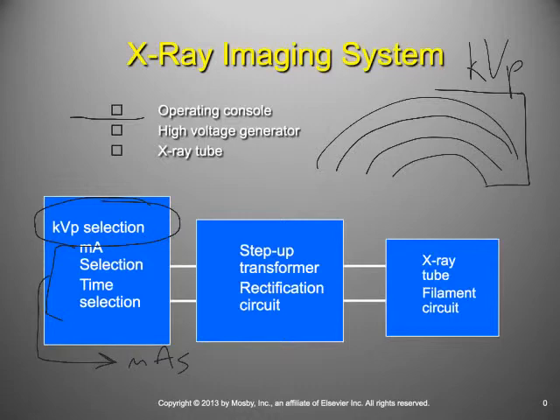So this is an amount of time that I'm going to charge something up with an amount of energy, right? So you'll notice I've got kilovolts up here and milliamps down here. Put that in the back of your mind. File that away because that's a big part of what we're unpacking when we unpack the circuitry of an X-ray tube. I need something that produces kilovolts and then a separate circuit that produces milliamps, okay?